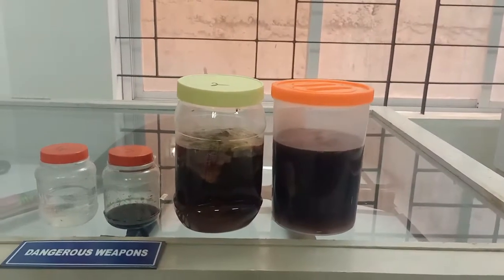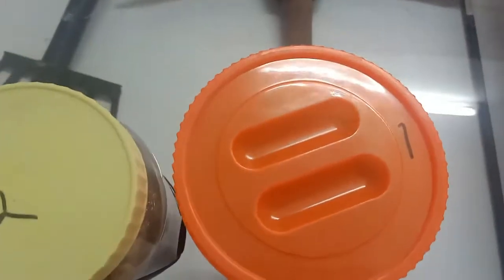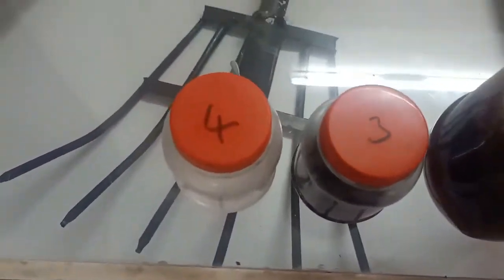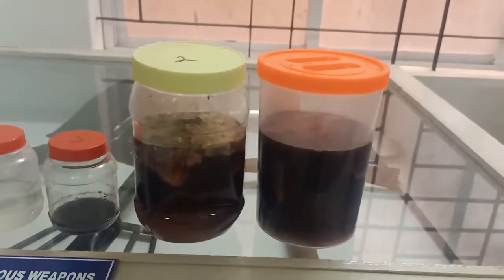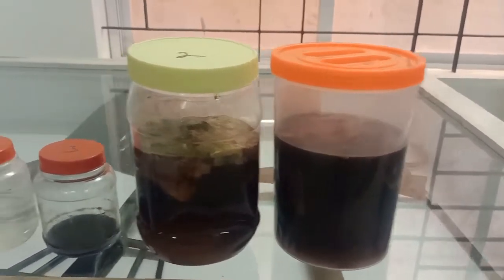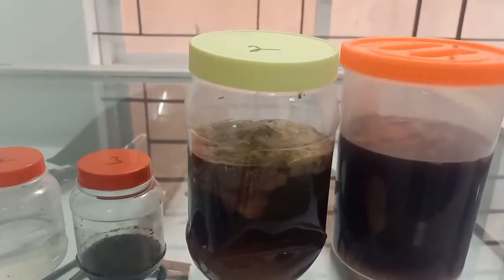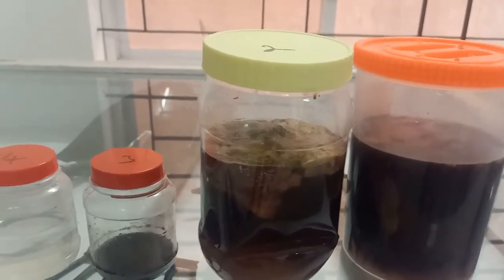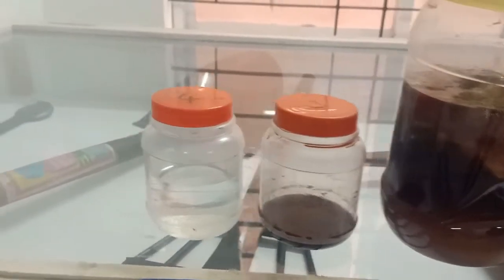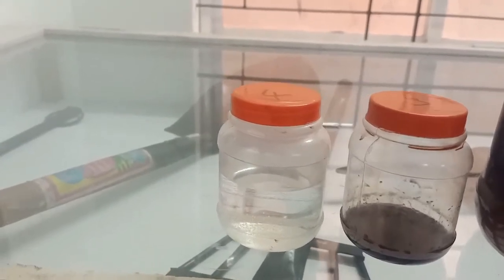The viscera have been collected in four containers and marked initially for identification. Bottle number one contains stomach and its contents and small intestine and its contents. Bottle number two contains 500 grams of liver with gallbladder and one half of each kidney. Bottle number three contains about 30 ml of blood, and bottle number four is the sample preservative, which is saturated sodium chloride solution.